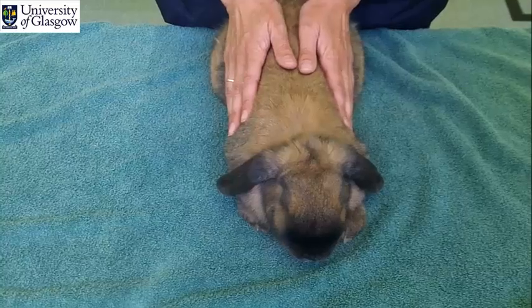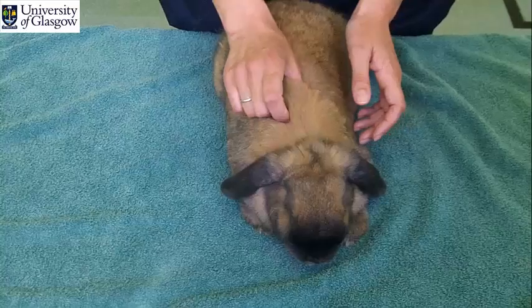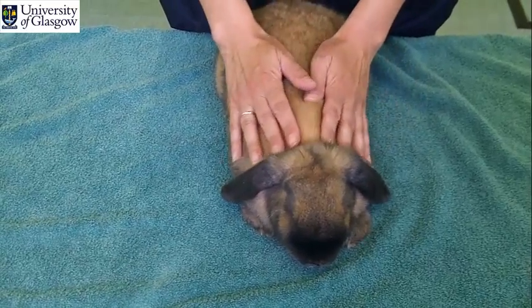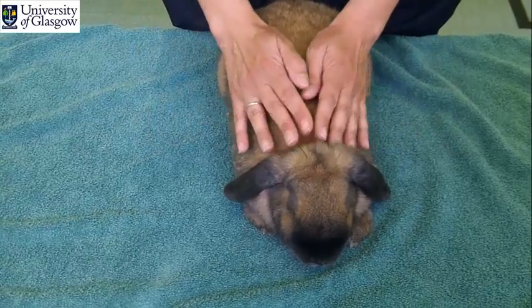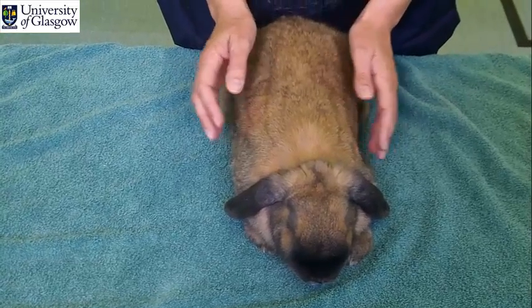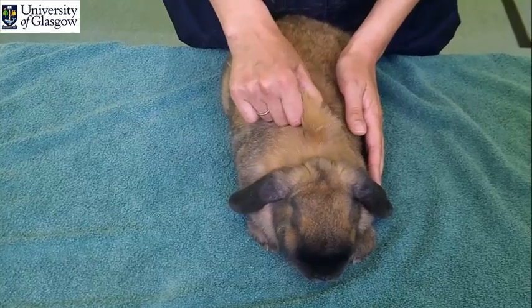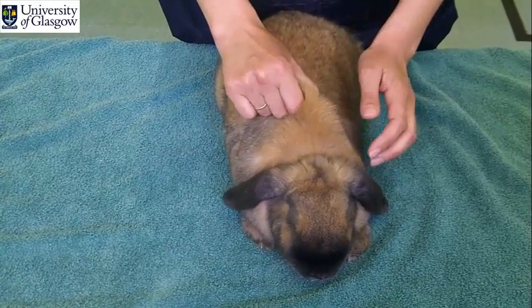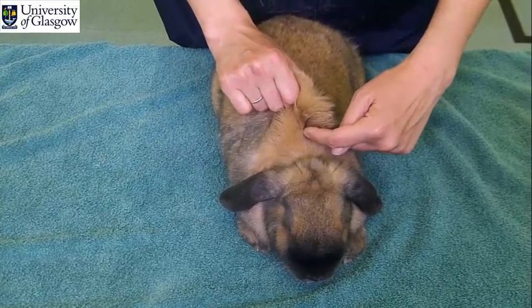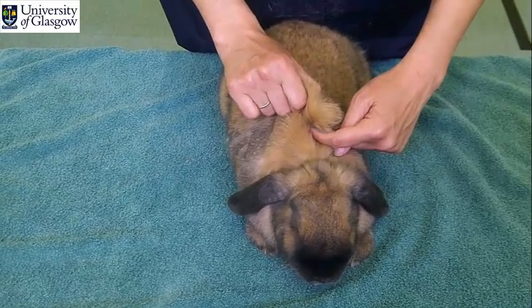The first one, the subcutaneous injection, can be done in the loose skin, and the best area is probably the scruff area, but all the rest of the back can be used for subcutaneous injections. We just need to gently scruff the rabbit and pull the skin in this way, so we can do our injections, and there is a lot of subcutaneous space on the skin.